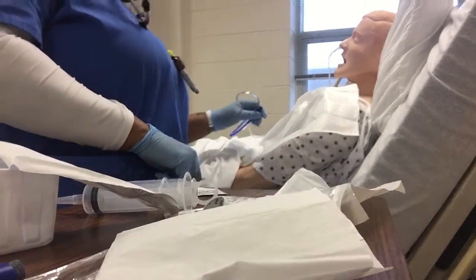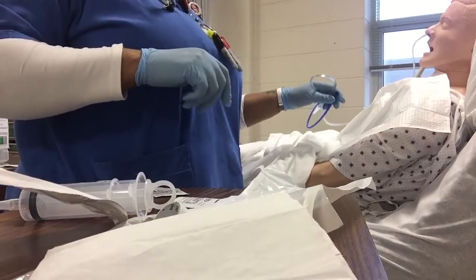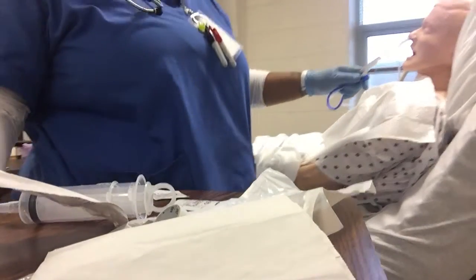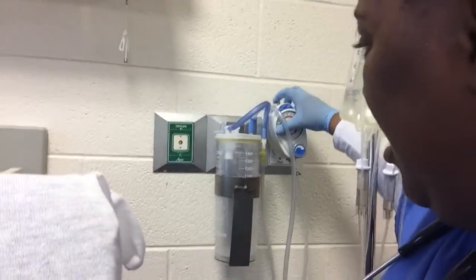This is placed. Now I will hook it up to the intermittent suctioning on the wall. So here, I will ensure that it's set to intermittent on the wall.